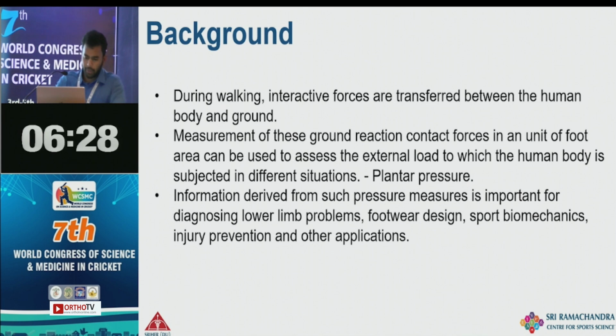During walking, interactive forces are transferred between the human body and the ground. Measurement of these ground reaction forces in a unit of foot area can be used to assess the external load to which the human body is subjected in different situations. This can be measured as plantar pressure. Plantar pressure is useful in diagnosing lower limb problems, designing footwear, sports biomechanics, injury prevention, and other applications.